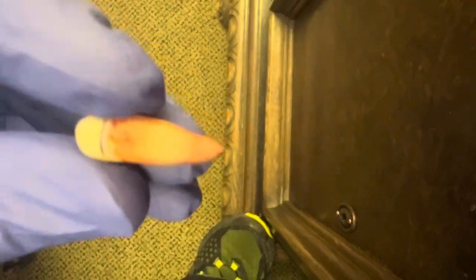We can zoom in here. I'm trying really hard with my phone. Come on, focus, focus, focus. Oh, maybe. There we go.